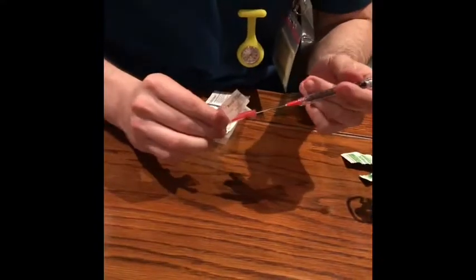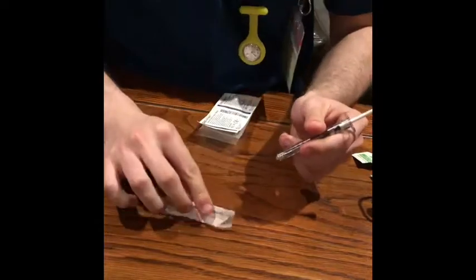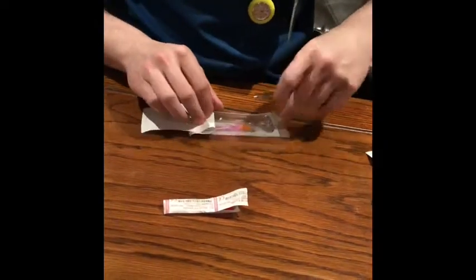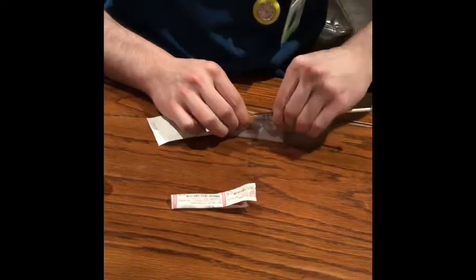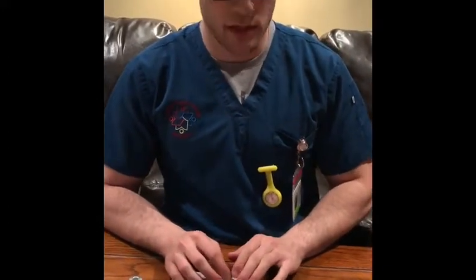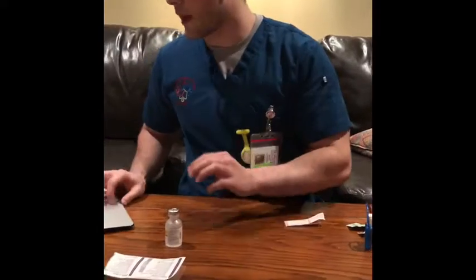We'll recap this filtration tip, place it in here and open up our syringe by applying our subcutaneous tip to the medication. And this makes sense considering it's heparin. It'll be long acting, so it would make sense to put it in as a subcutaneous injection. So after that, now that that one is done, we can prepare the intramuscular injection, which would be the Haldol.